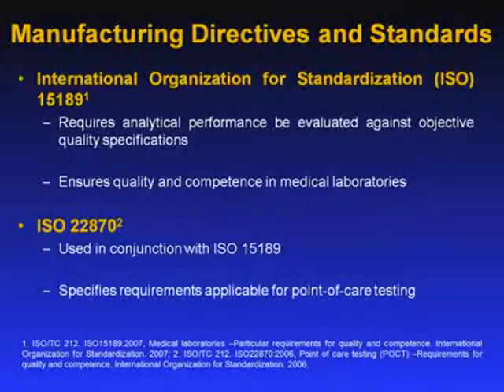The companion to the IVD Directive 98/79/EC is the International Organization for Standardization, or ISO 15189. This standard is the successor of ISO/IEC 17025 of 1999, which originally stated the general requirements for the competence of testing and calibration laboratories. ISO 15189 is the main and current standard for quality and competence in medical laboratories. It states that analytical performance of clinical laboratory testing should be evaluated against objective quality specifications. For example, external quality assessment determines how a particular IVD is performing in comparison to similar IVDs, which is key, or other laboratory tests such as gold standards. The ISO 22870 specifies requirements applicable to point-of-care testing and is used in conjunction with ISO 15189.